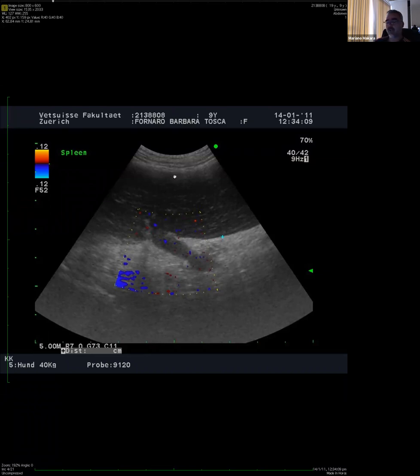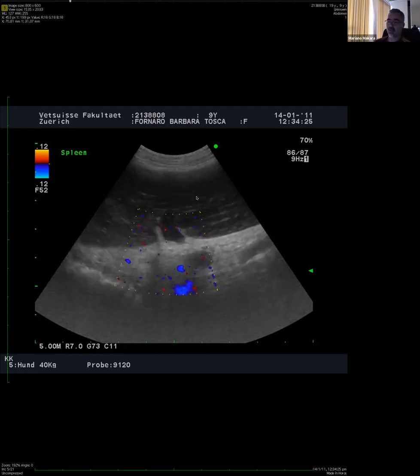The first thing that I would probably mention in terms of spleen, how it looks here, is that there seems not to be any focal lesion. Makes sense? So there's not a cavitation, whatever, anechoic, hyperechoic, or hypoechoic. There are no masses, no focal lesions. It seems to be just enlarged, and I can show you multiple images that they all look the same.